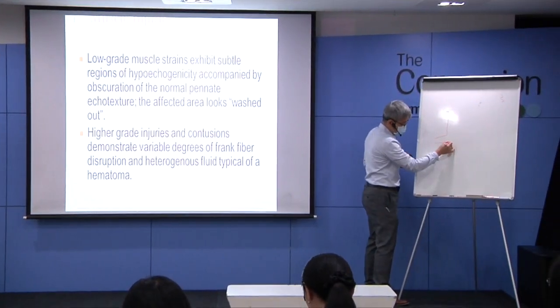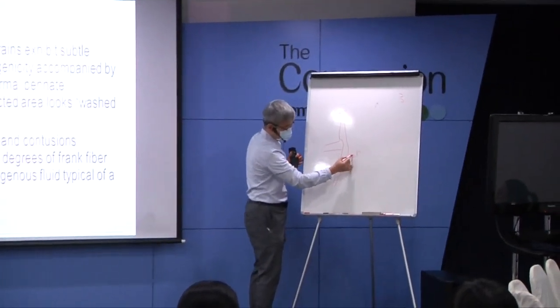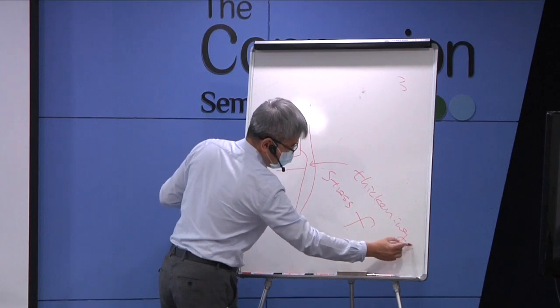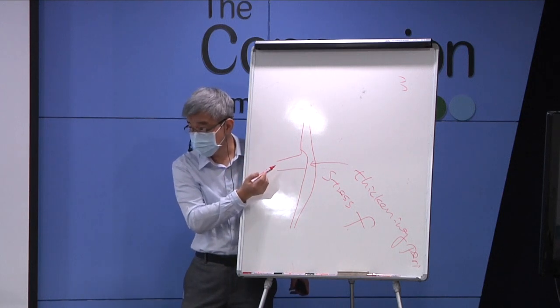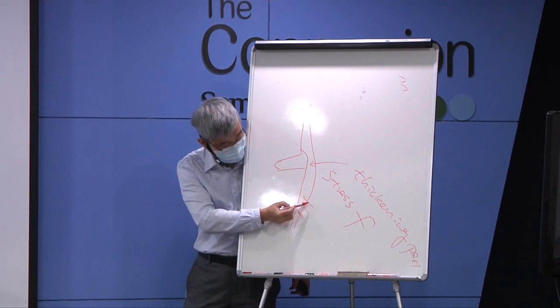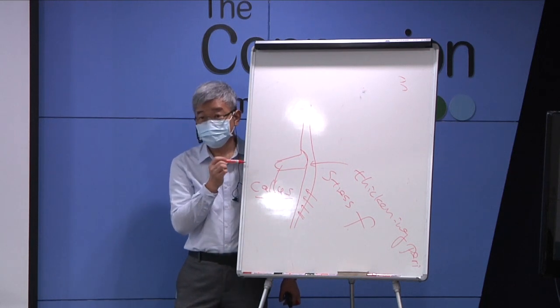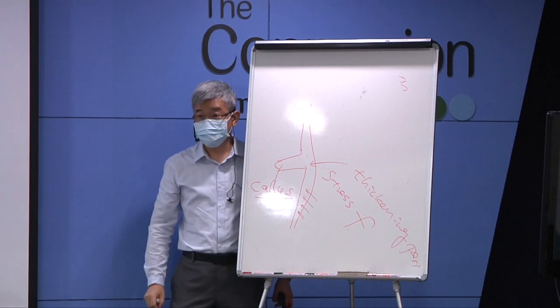This is the bone. If there is a stress fracture, and you found thickening periosteum. Okay. This is the fracture, tiny fractures. And you found that the periosteum has become thickened. And you found a callus here. C-A-L-L-U-S, callus. You can start weight bearing. Without the callus, okay, immobilize.